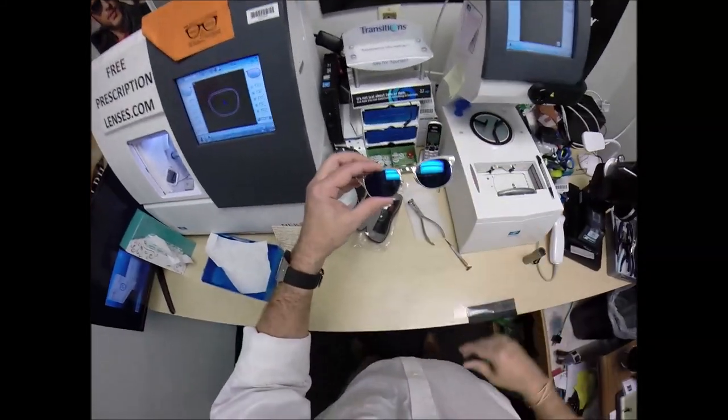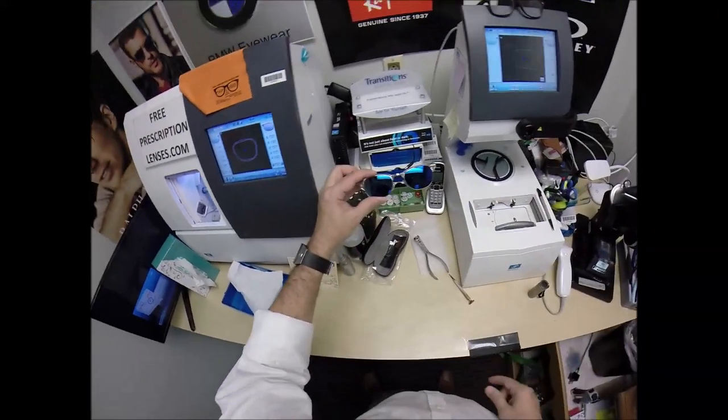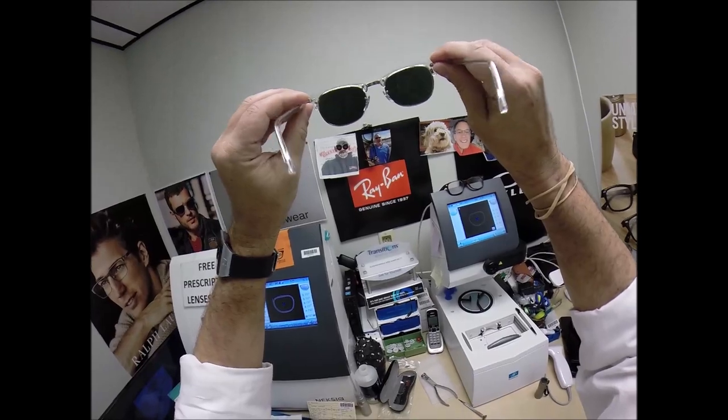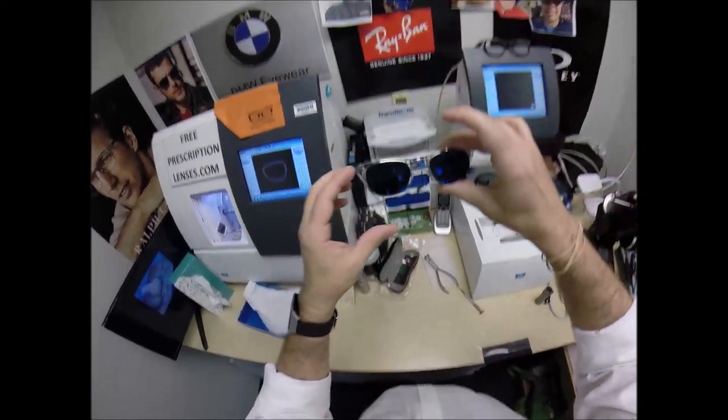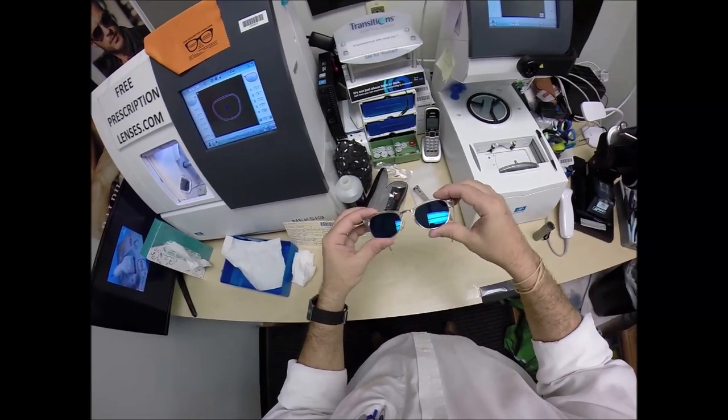Look at that — look at that! That is just tough — that's what I'm talking about. Come on, Essilor, you bring the heat! The mirror coating comes in silver, gold, green, blue, red, and pink. When you look out, that's what you see. When people look at you, that's what they see. Now, it's not as reflective as true sunglass lenses — it has to be at a certain angle.